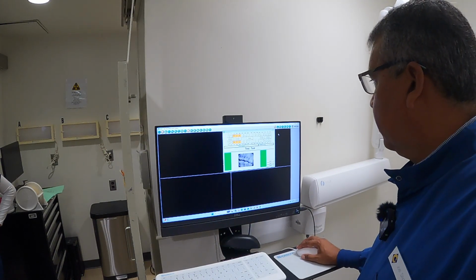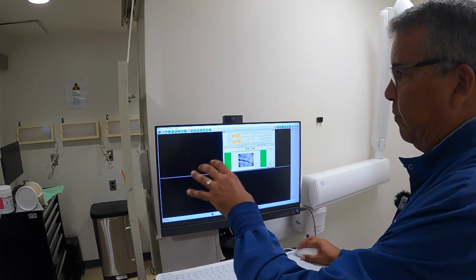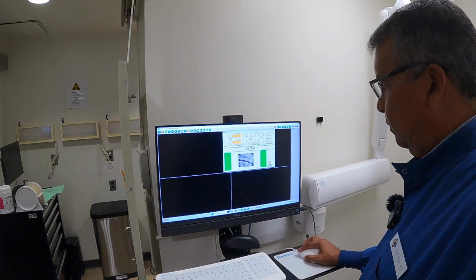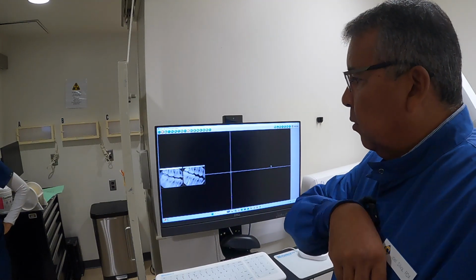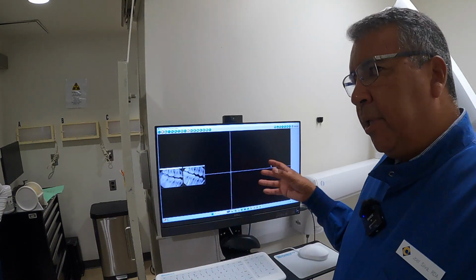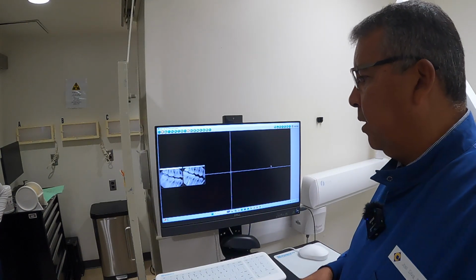Then you'll notice that when I do it, it'll throw the images onto the screen to where its perspective spaces were. There it goes. Okay. So the goal today is to try to complete all of them, but if it doesn't, I'm not concerned about it. I just kind of want you to get your feet wet a little bit and get this right side on there, and then we'll kind of work on the left.